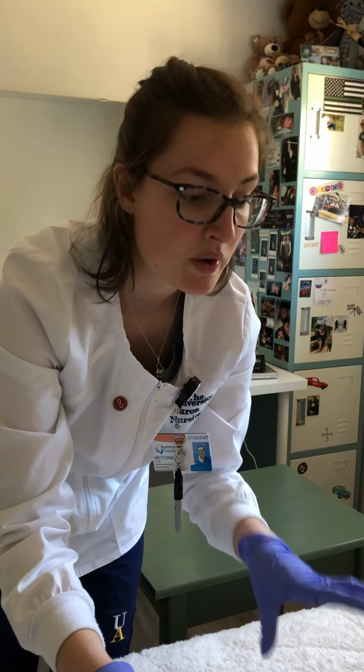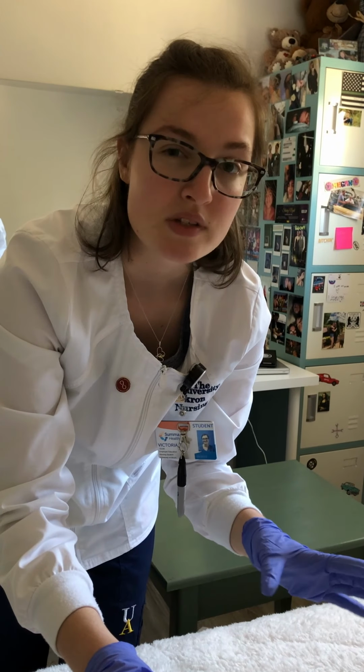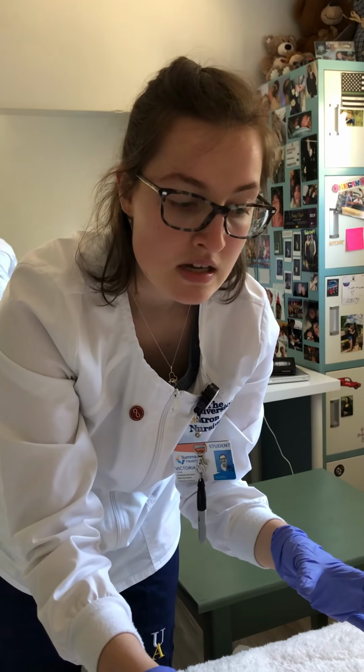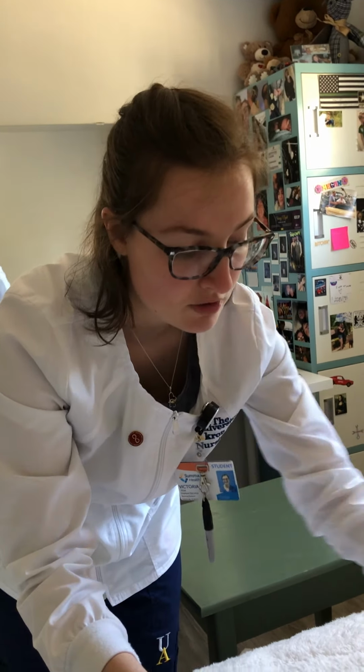But before I do that, I want to inform the patient that they are going to feel my touch. That's important throughout the entire procedure. This is not the most comfortable procedure for a patient to undergo, so we just want to make it as comfortable for them as possible. So I tell my patient they're going to feel my touch.